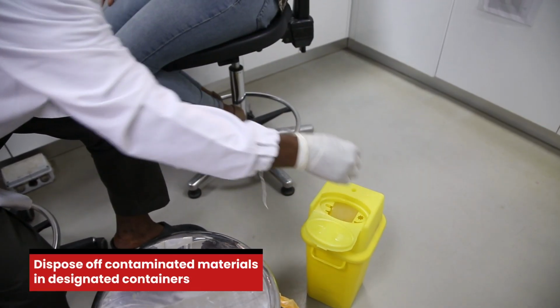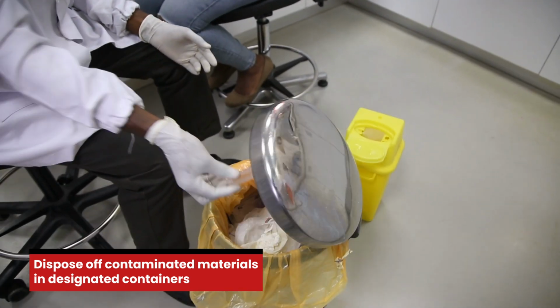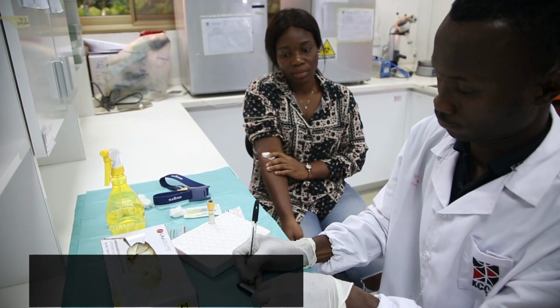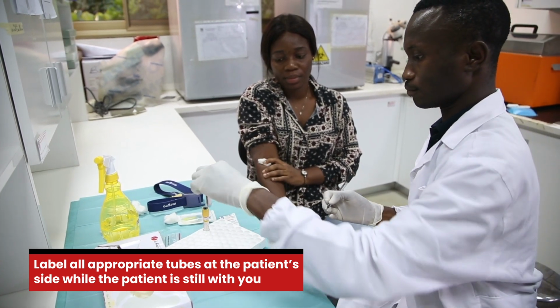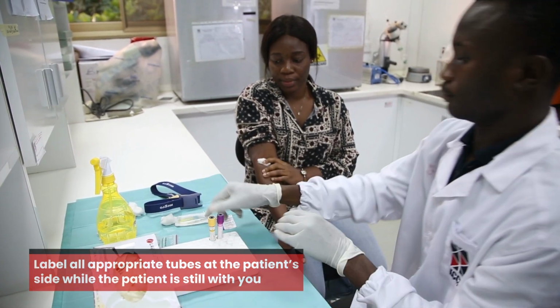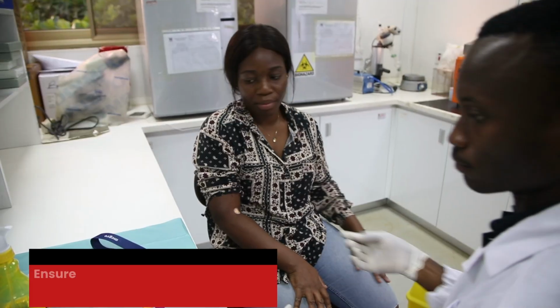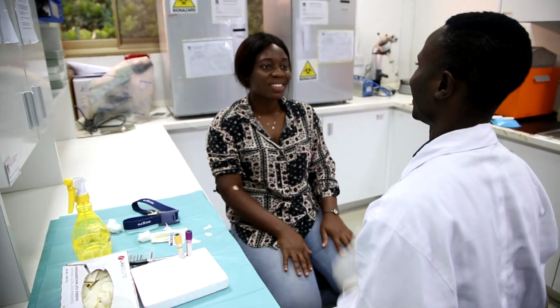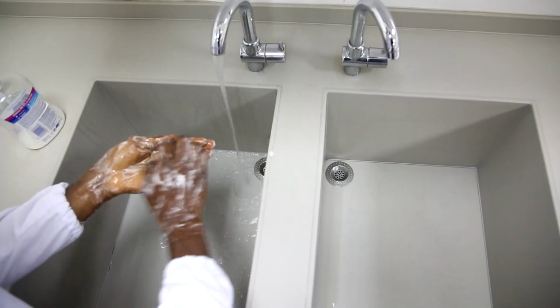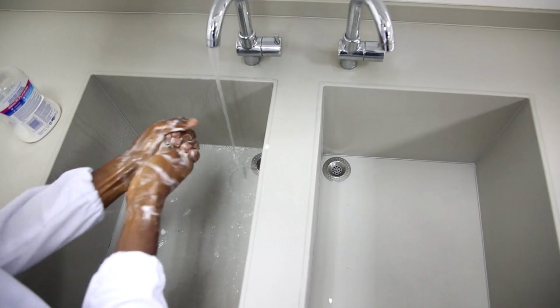Dispose of contaminated materials in a designated container. Mix and label all appropriate tubes at the patient's side while the patient is still with you. Ensure the patient is feeling okay after the procedure. Deliver specimen promptly to the laboratory for processing and then perform hand hygiene.